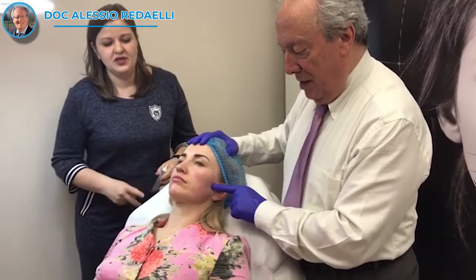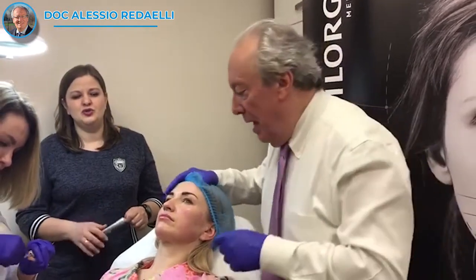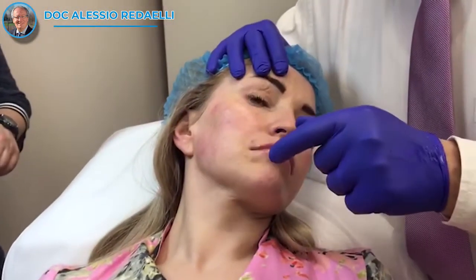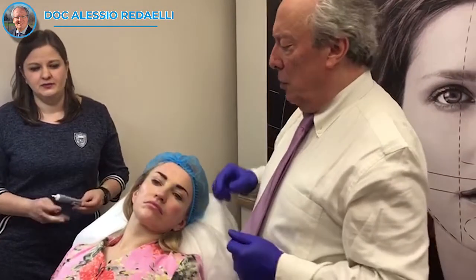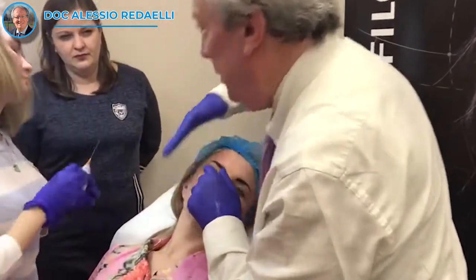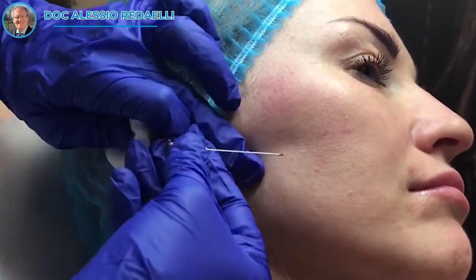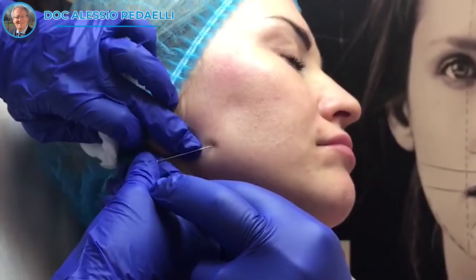You see I left some because I like the zygomatic line, but in this case it is a little bit too much. So in this case we add a little — 0.5 ml of NCTF — to make it less visible. Again with the cannula: from here you enter, you turn and go down. From here I take — not so high — you see where it is here.